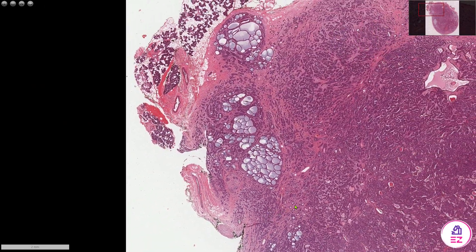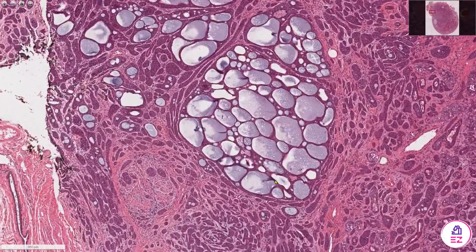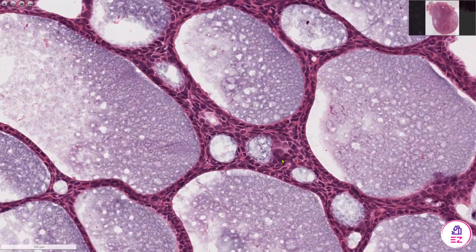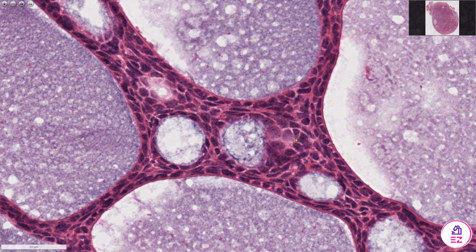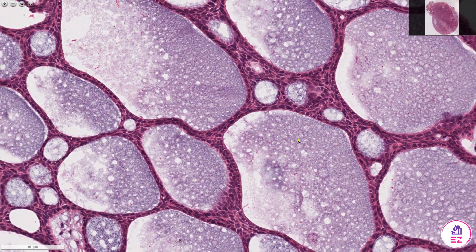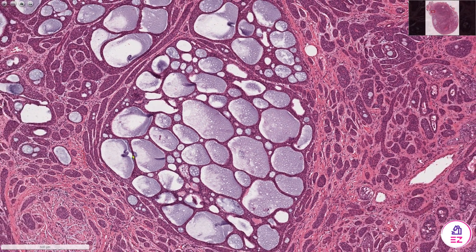In an adenoid cystic carcinoma, you typically see cribriform, tubular and solid patterns. This area here is quite nice for the cribriform pattern. We've got very dark angular cells associated with this kind of myxoid and sometimes hyalinised matrix or globules, giving this Swiss cheese or cribriform pattern.